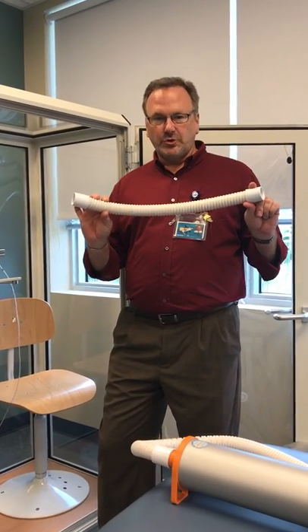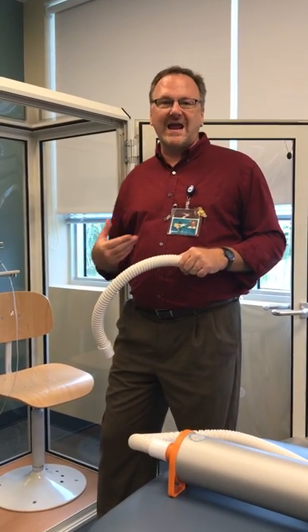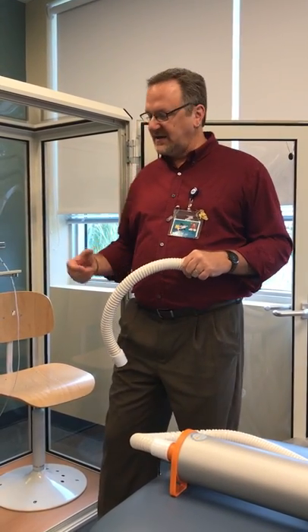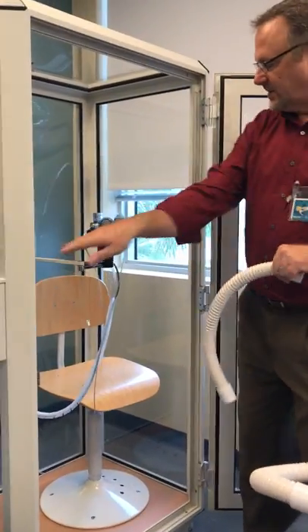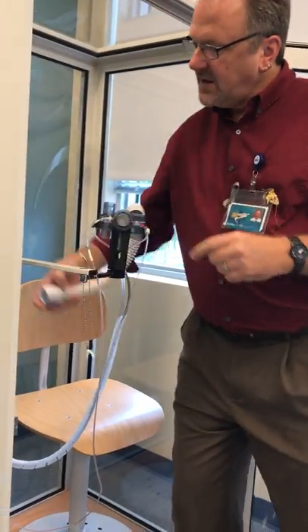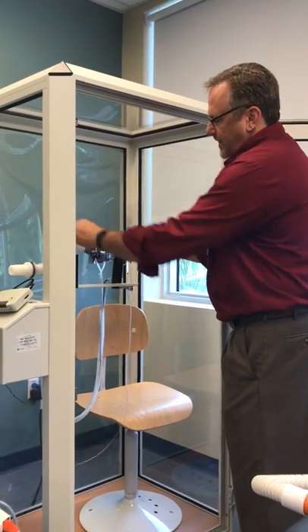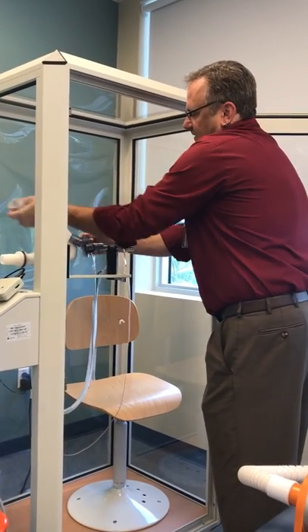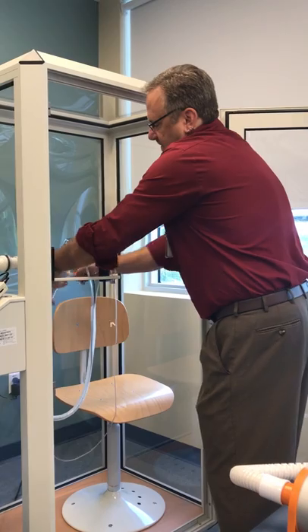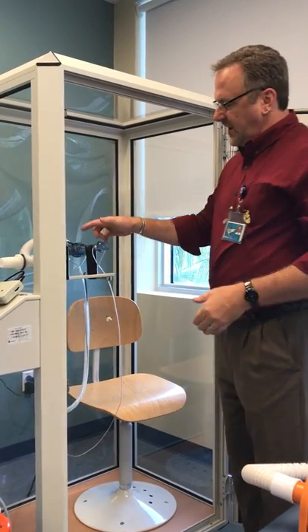This is a transmural tube. This is designed — if you remember the transmural definition — for breathing outside air while a patient is taking a test. This goes on the output of the pneumotach and will connect to the port that connects to the outside, and then this would go in here. You have to do a little twisting on it, and then your patient would do the test while they are in the box.